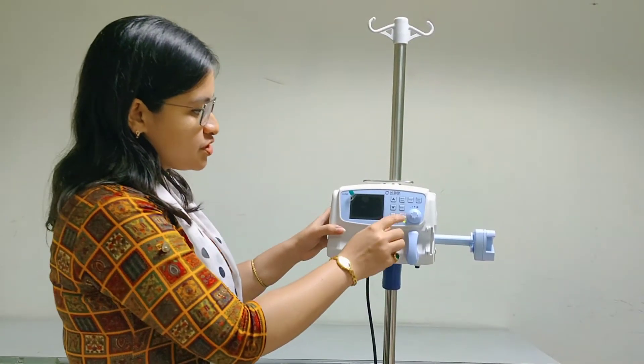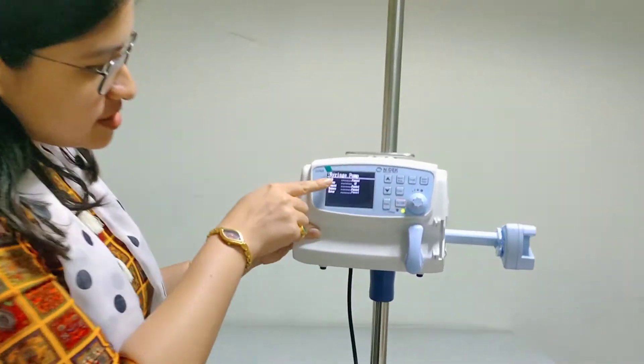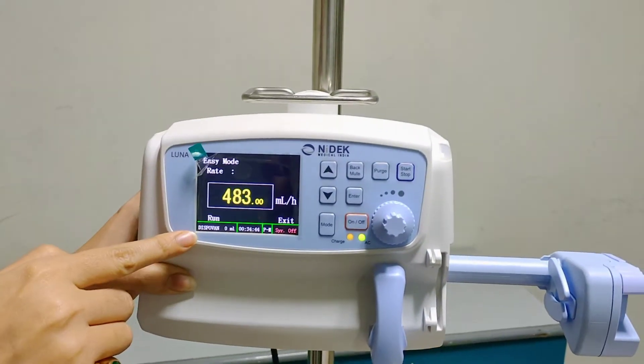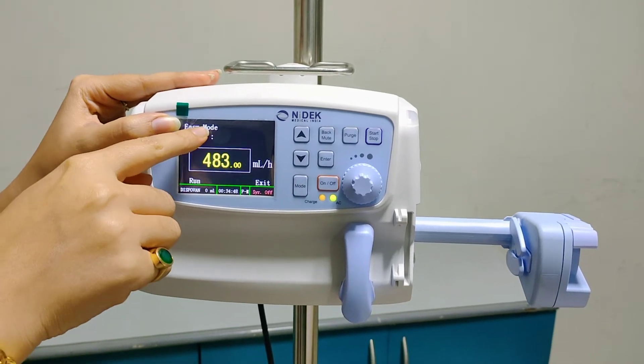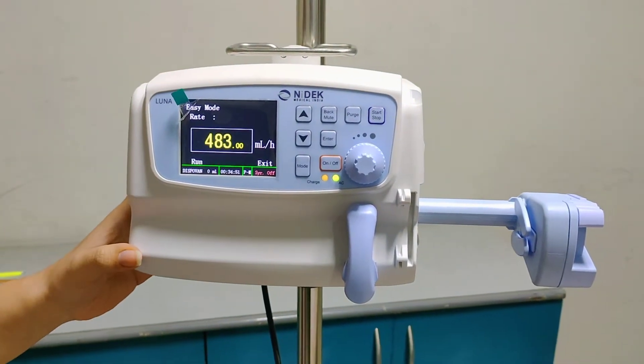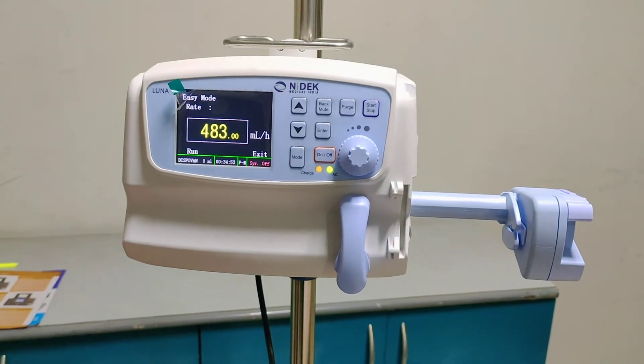Now we will switch on the syringe pump. This is the self-test that is done once the syringe pump is switched on. And now, as you can see, the syringe pump is running on the easy mode, which is the most user-friendly mode of the syringe pump.